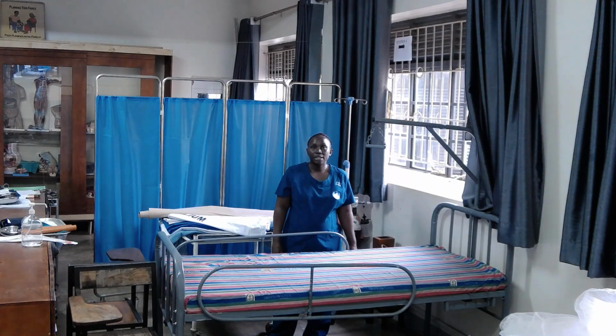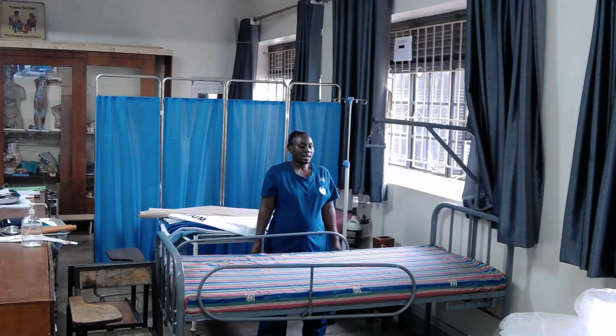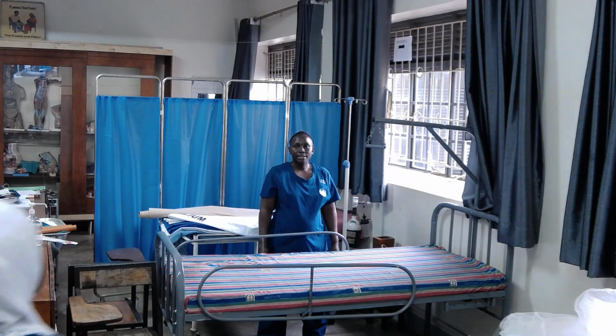So since bed making is a 2-nurses procedure, I'm going to call my assistant so that you can make this bed. Thank you.